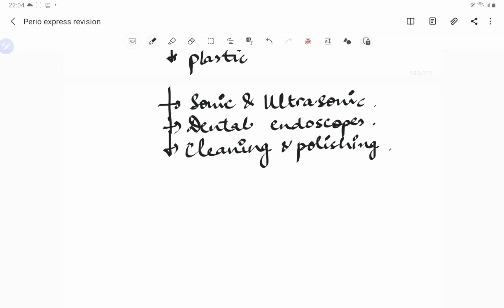We will cover the rubber cups, the brushes, and dental tapes for interdental scaling. Dental tapes are just like floss, but like a thin sheet rather than a thread. Also we have air powder abrasive systems, in the scaling and root planing, I mean the cleaning and the polishing instruments. That also we will cover in this part of the video.